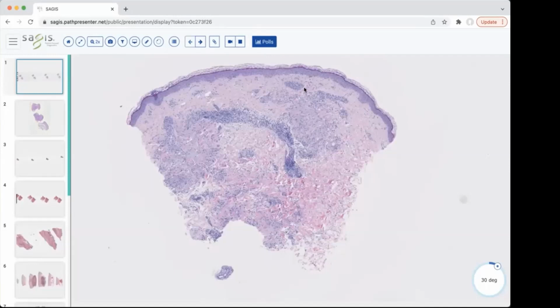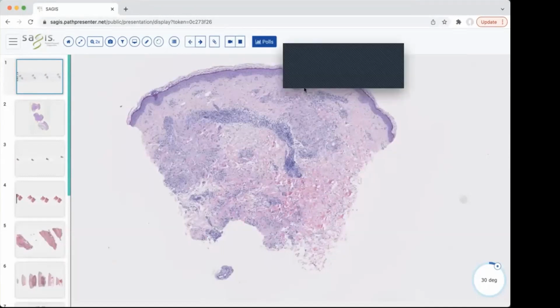But what someone says when they're talking about granulomatous dermatitis is really that the histiocytes predominate in the inflammatory infiltrate. So there can be a smattering of other cells, but the histiocytes are what take charge and are most noticeable. Pathologists use the terms histiocytes and macrophages interchangeably. You'll see that in the literature, it just goes back and forth. So keep that in mind.